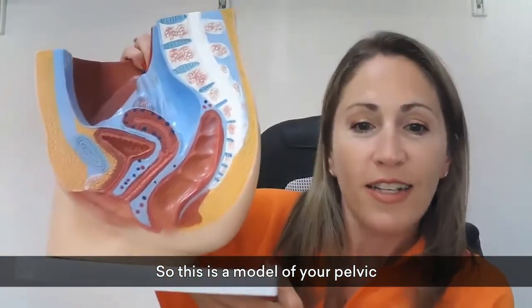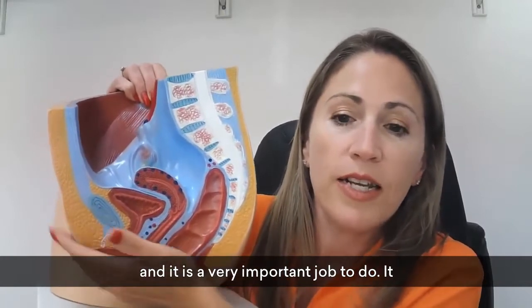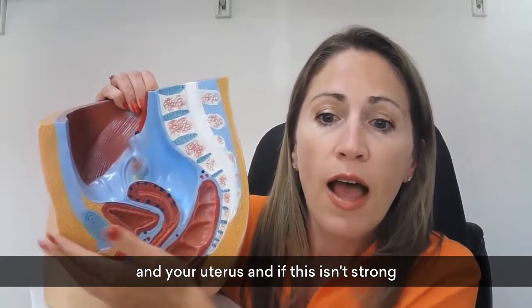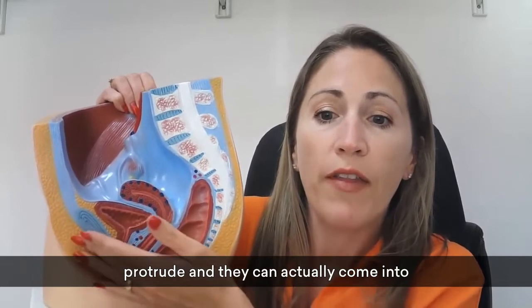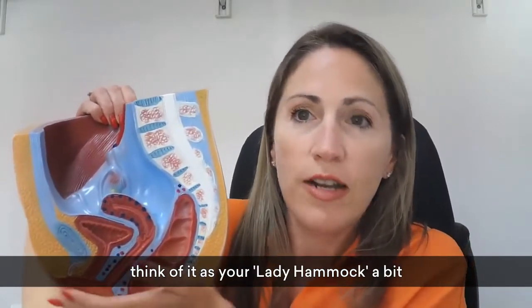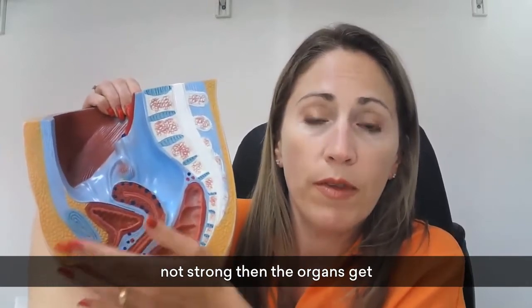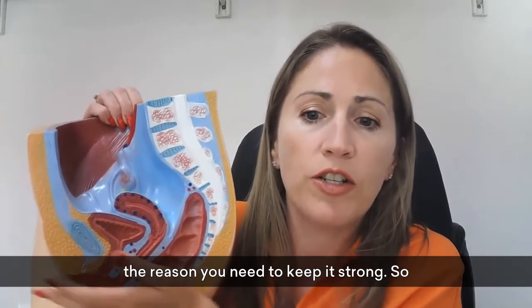Here is a model of your pelvic floor. It has a very important job — it has to hold up your bowel, your bladder, and your uterus. If it isn't strong, your organs can start to protrude and actually come into your vagina, which is known as prolapse. Think of it as your lady hammock, a bit like a trampoline. If it's not strong, the organs fall down — so that's why you need to keep it strong.